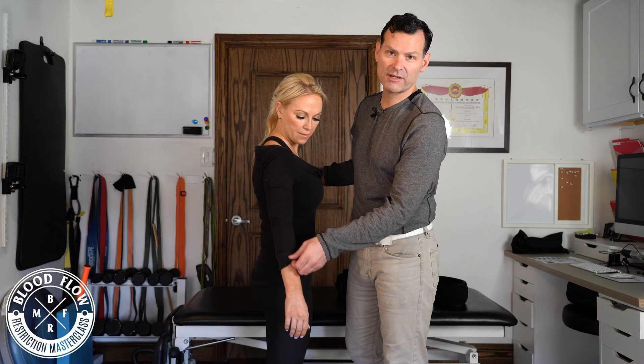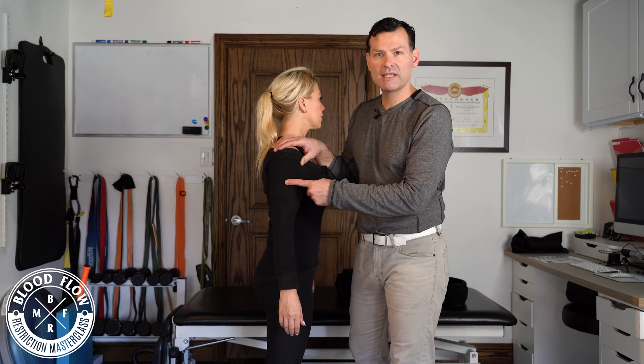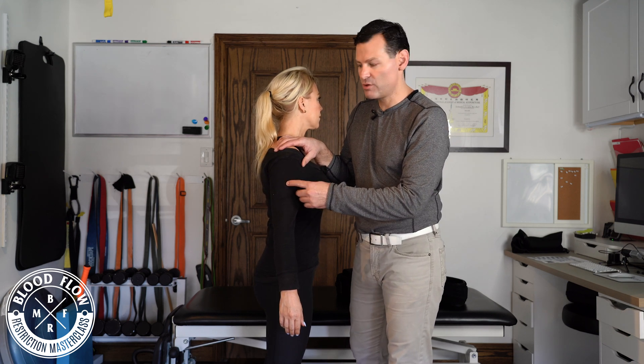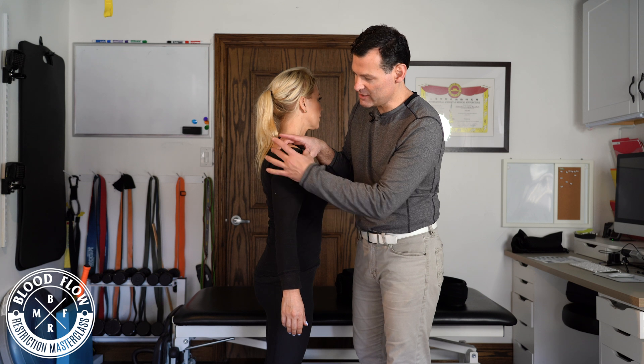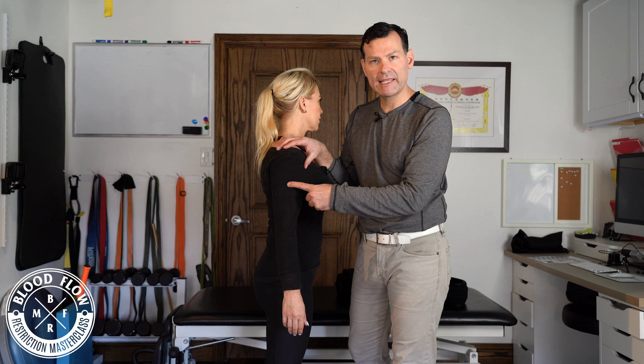The first thing we need to do is look for a couple landmarks. My first landmark is going to be the deltoid tubercle. Where the deltoid comes in, you'll see this nice V, and it comes right to that point. That's my first landmark.